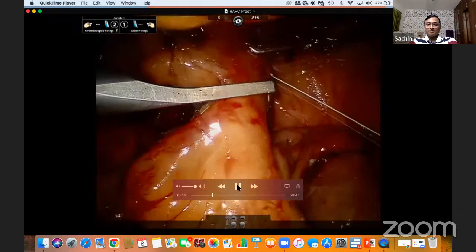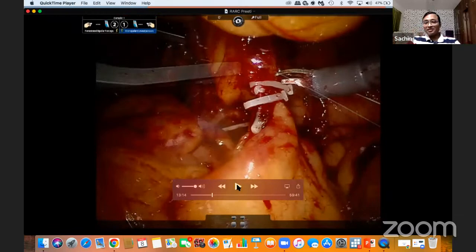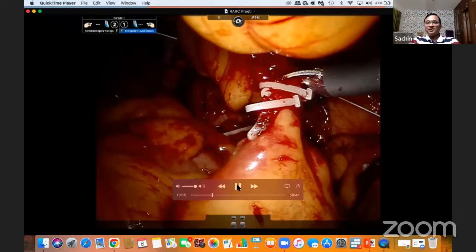So it keeps the urinary tract away from the enteric tract. If both of them are almost adjacent, the ureteroileal anastomosis and the bowel anastomosis almost next to each other, this will be slightly farther away from the ureteroileal anastomosis. Another thing, it gives extra mobility for our conduit to come up outside the anterior abdominal wall. That's the principle. The principle is good, but looks a little unfair.